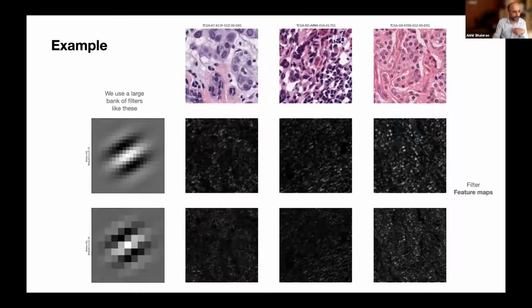So here I've run a quick example. On the top row, I've got 3 images, and I've taken 2 of my filters and I've run them to produce maps, which are the Gabor filter outputs. These are the feature maps. So on their own, they don't look very exciting. It's when you put them together that you find that they will capture particular characteristics of the different images. And you can already start to see with that first row that the 3 images, the image maps, look very different.